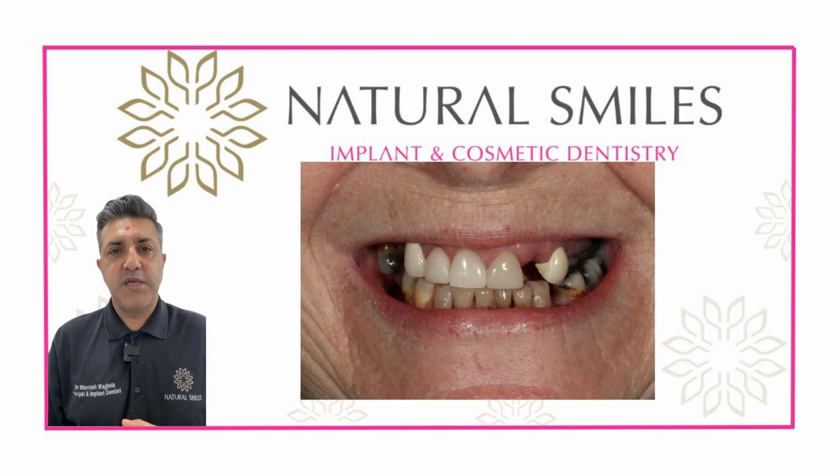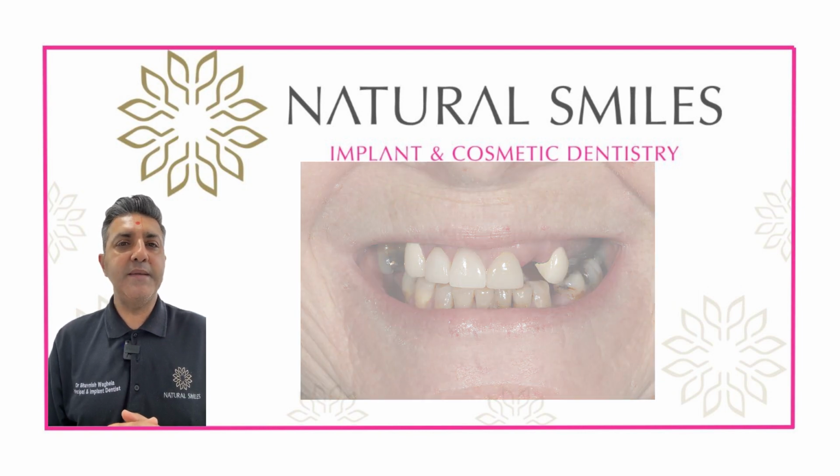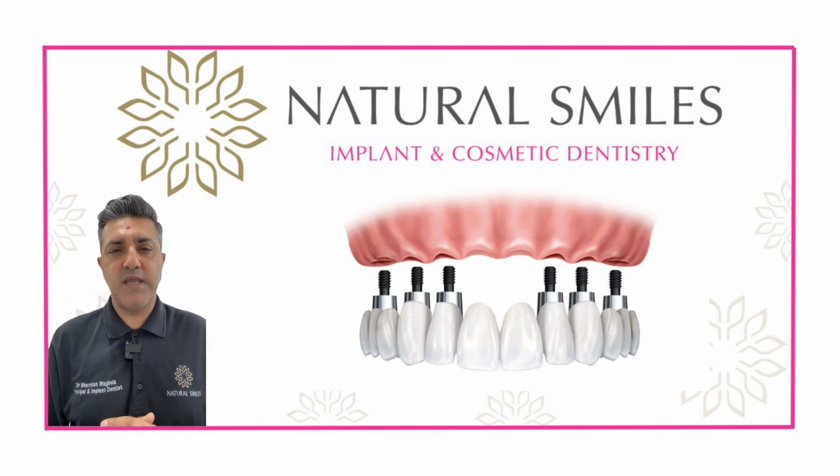Some patients have not really lost much gum, and we're able to replace teeth that need to be replaced, a whole set of teeth, using a system which we call FP1.